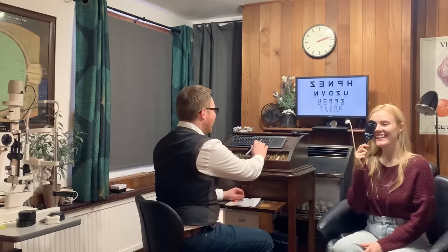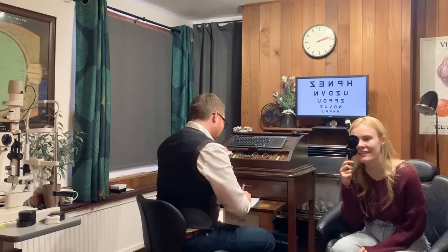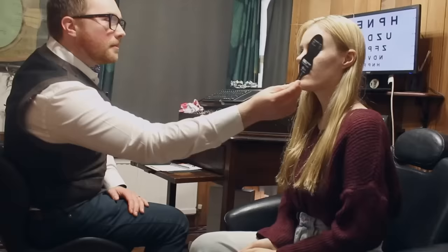If I blinked. Now I've added an extra line. Can you get anything on that bottom one? It's sort of really pushing it. Yeah, I don't think I can actually. Don't worry. That's fine. No, I'm not getting any of that. Don't worry, that's fine. So if I take the cover again and we have a look back at the 6 o'clock position on the clock, let's just see your eye muscles again.